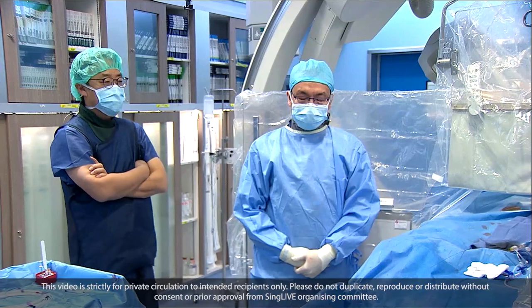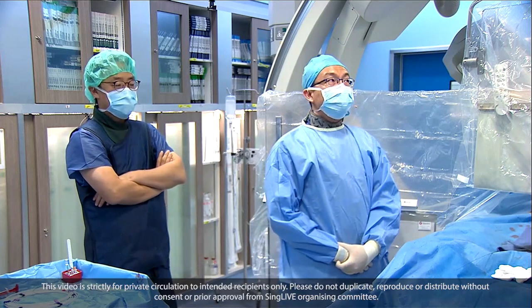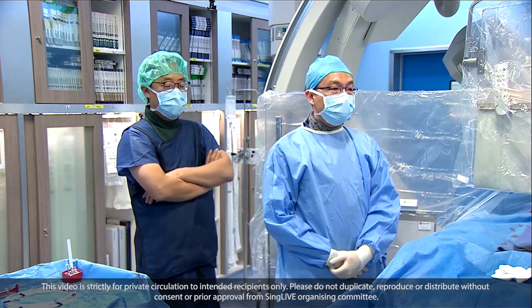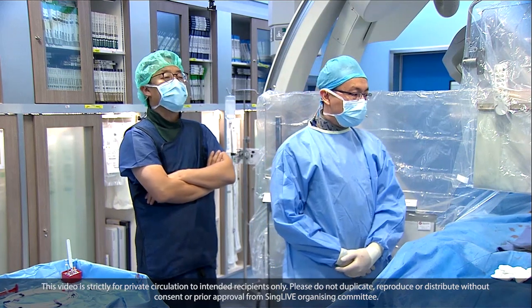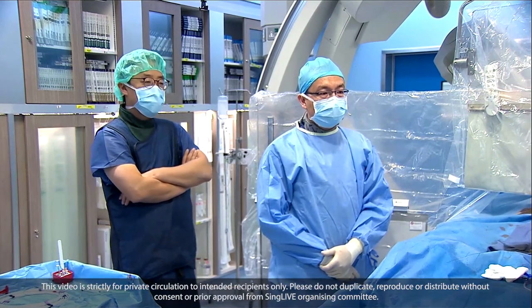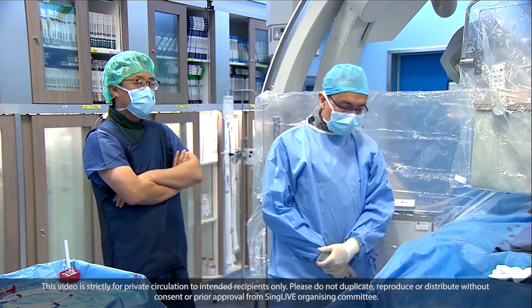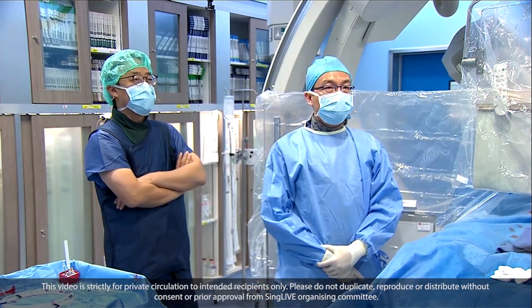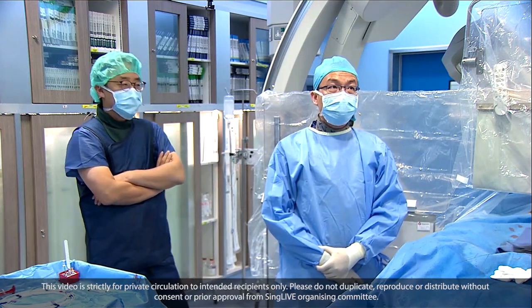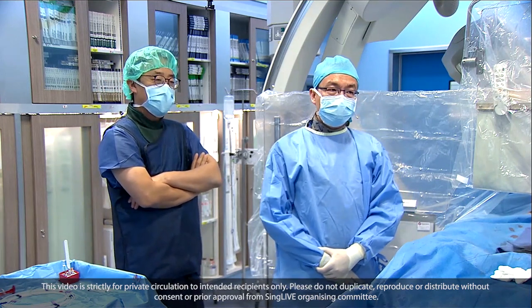Okay, we get another opinion from India, Dr. Ashmi Mehta. Yes, it's really a complex situation. A distal bifurcation left main is always challenging. And yes, imaging, and since it involves the left main, IVUS may be the preferred imaging modality. As for Shockwave, I don't know whether it's applicable because I have no experience with it. But certainly this case cannot be done with adequate lesion preparation without rotablation. That is for sure. In India, upfront rotablation will be the choice for lesion preparation.